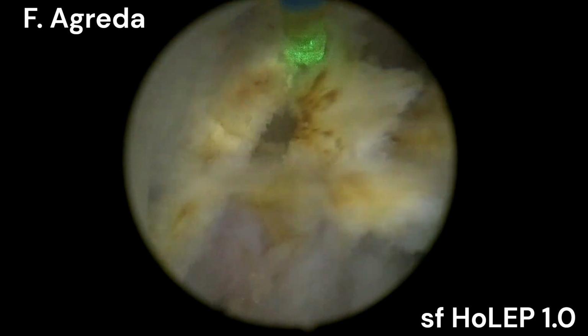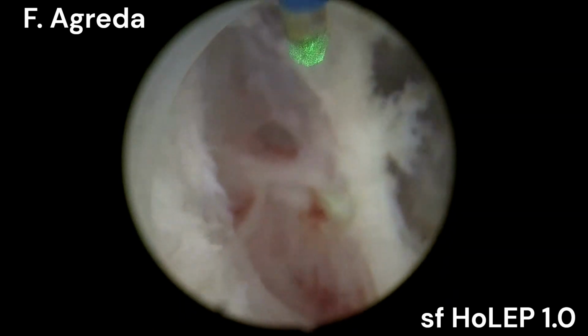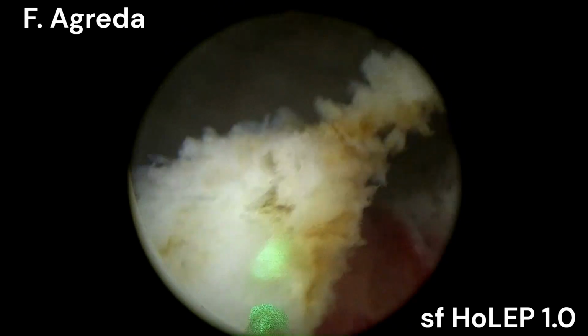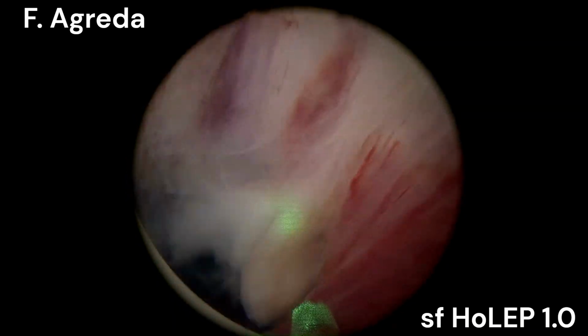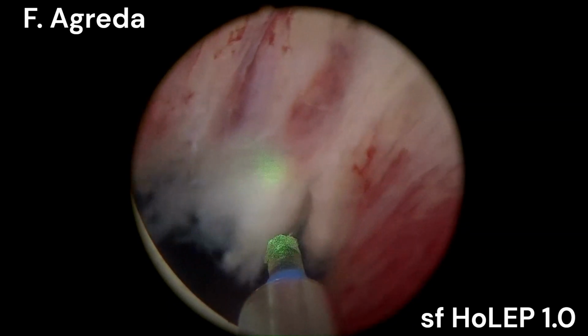I think this is the way to go in the treatment of benign prostatic hyperplasia. Last view of the prostatic fossa, and the last view of the sphincteric preserved mucosa here, completely preserved. There's no risk of stress urinary incontinence in this patient.